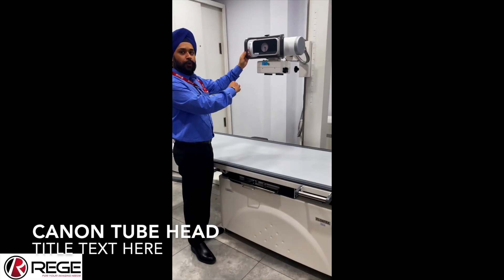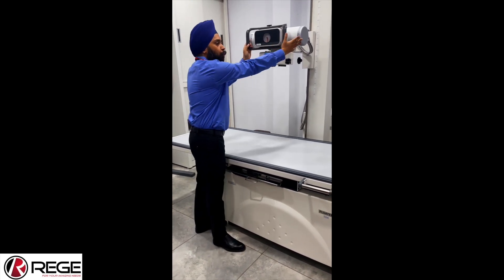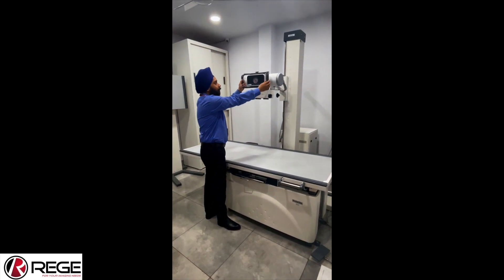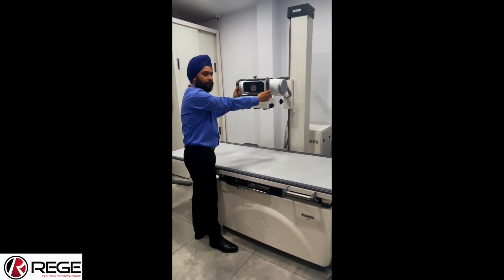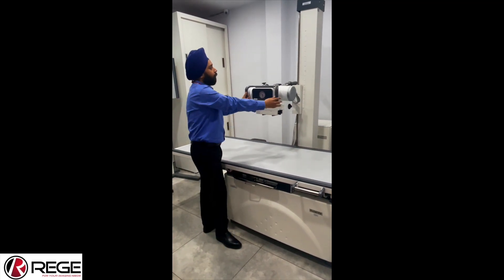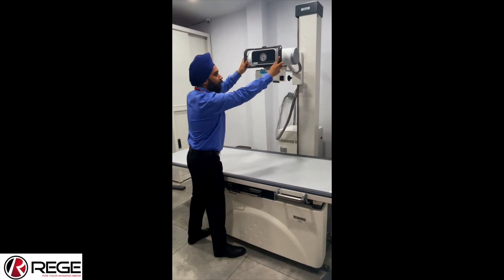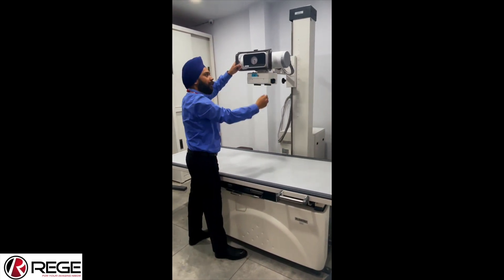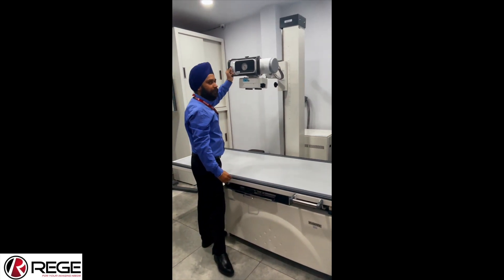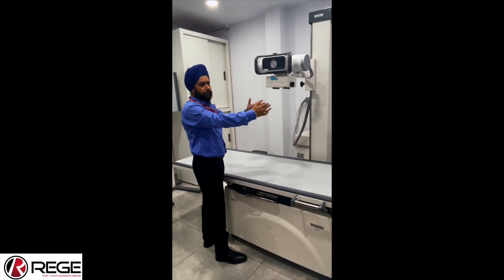Now I will show you the vertical stand of our X-ray machine. This is the tube head and I will show its movement. First, we can take it down to decrease the distance between the patient and the tube head. You can also take it up in the same way, and you can also move it right and left. It is a very easy single-handed movement — I can move it with a single hand with little force, and whenever I stop, it automatically stops. It does not fall back.